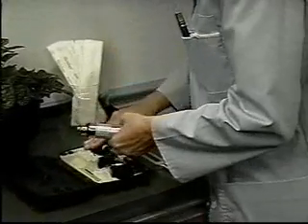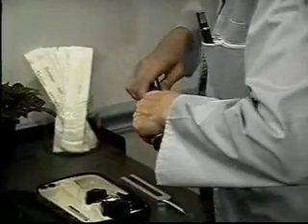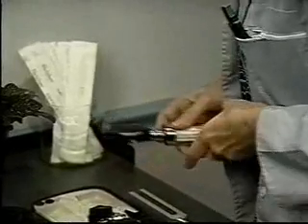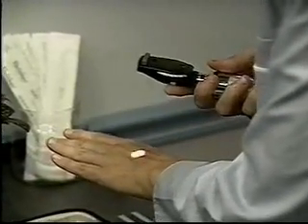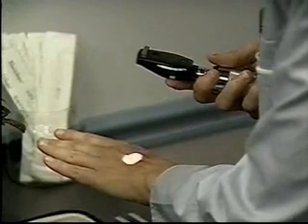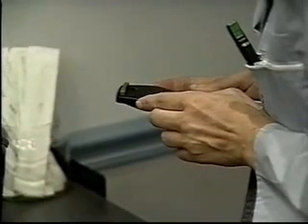When you're ready to examine the fundus, switch on the ophthalmoscope light and adjust it to the large round beam of white light. Also, make sure the light is bright enough. Set the ophthalmoscope to zero diopters.